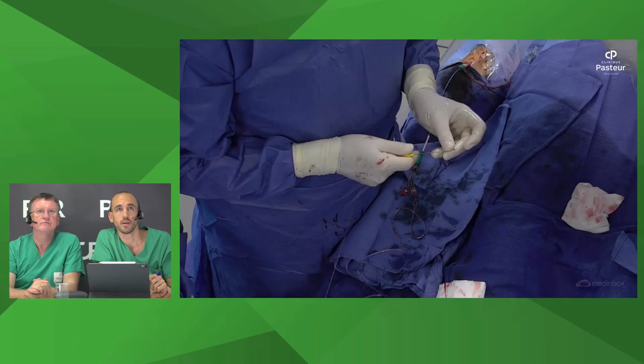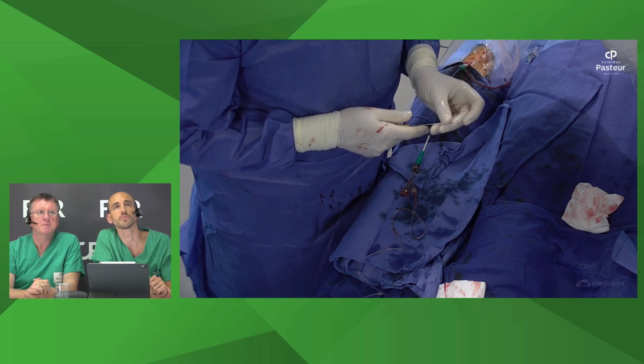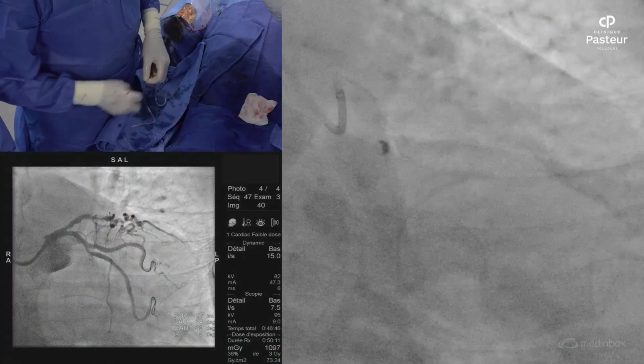Yeah. No, it's a dissection or aneurysm? I think it's a dissection. It's a little bit distal to the bifurcation, at the level of the curve, because there was a curve. So we retry with a wire with better support. You see the dissection? The risk now is to take the dissection.